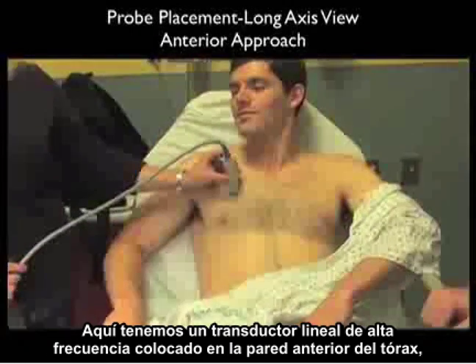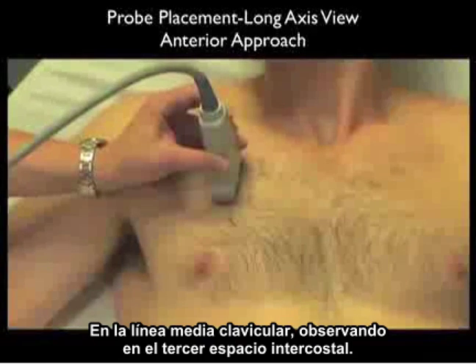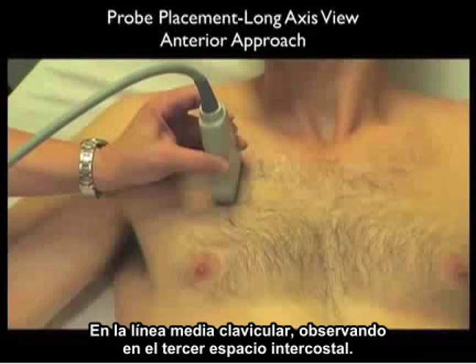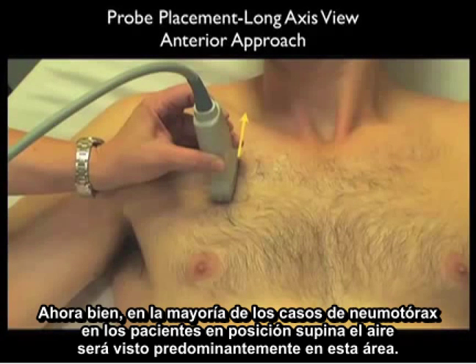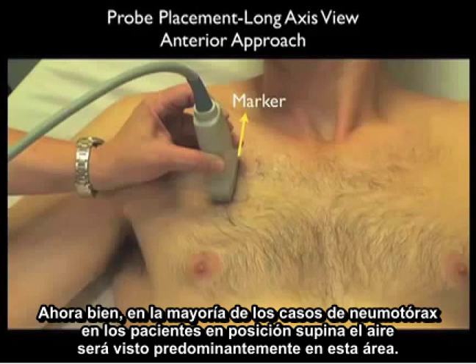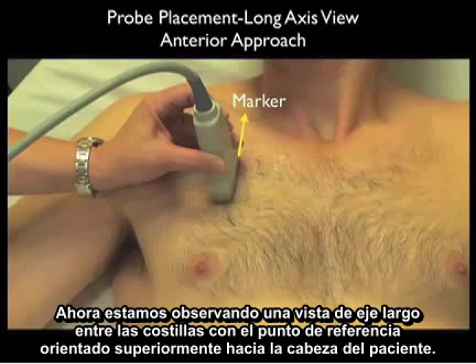Here we have the high-frequency linear array probe positioned on the anterior chest wall at about the mid-clavicular line, looking into about intercostal space 3. In most cases of pneumothorax with the patient supine, the air would be predominantly seen in this area. Note we're looking in a long axis configuration between the ribs, with the marker dot oriented superiorly towards the patient's head.